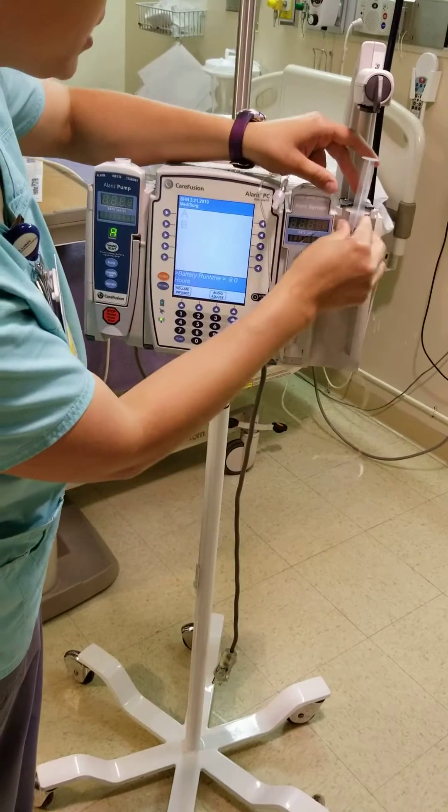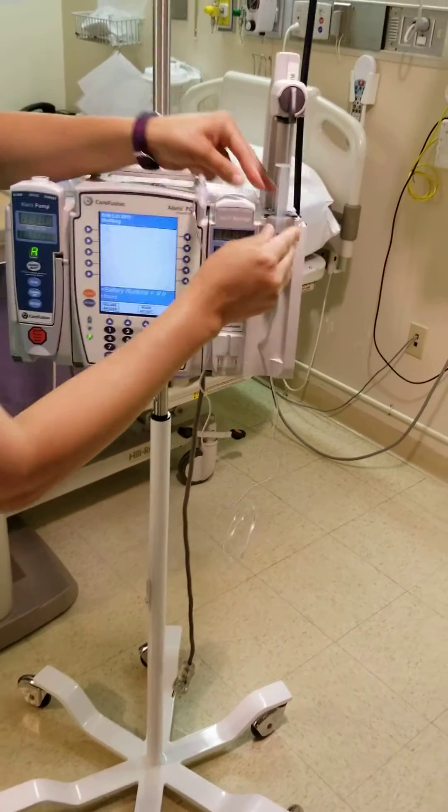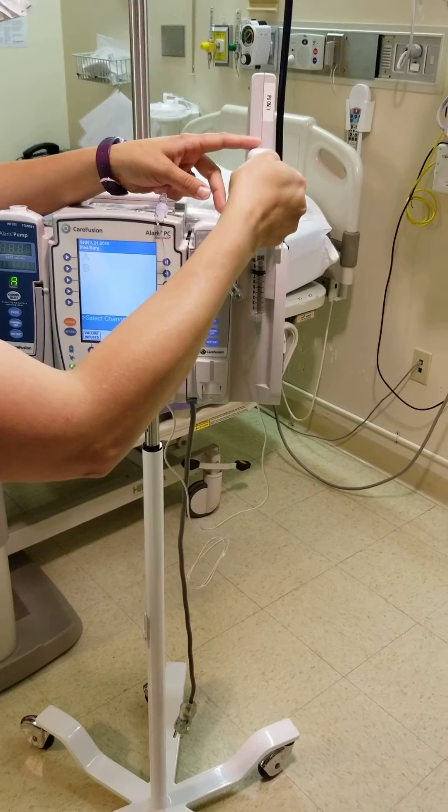Just like our PCA pumps, you put it in on the top. Get those little flanges in there, and then lower this gently.